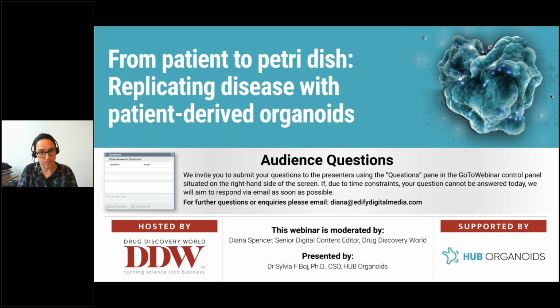Great. Next question. How do you control the relative growth of tumor versus fibroblasts to prevent the fibroblasts outgrowing the cancer cells? So this problem, you normally have it when you need to process tissue and do the isolation. It's true that on the establishment of an organoid culture from the tissue isolation, sometimes you bring into the cell preparation a fibroblast. Normally, what we see is that these fibroblasts tend to attach to the base of the plate. So you can see that in the matrigel dome, the organoids are growing inside the dome, but then you have some cells growing as a 2D layer. These are mainly the fibroblasts.